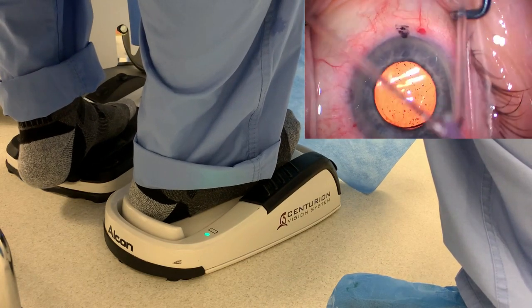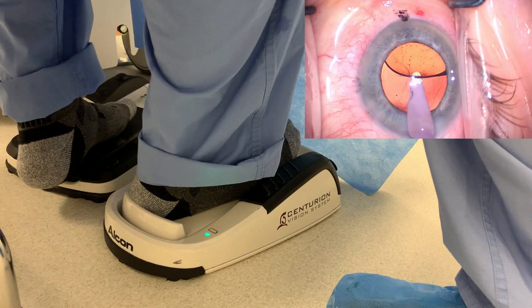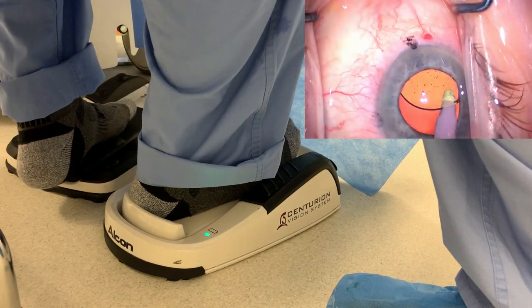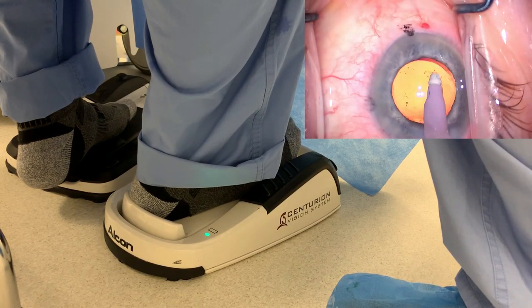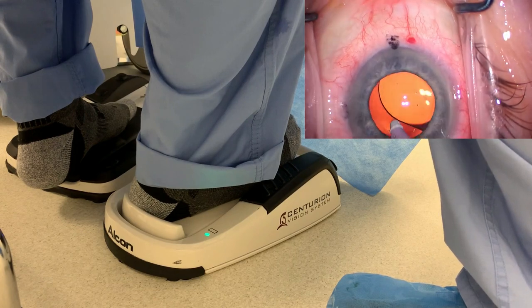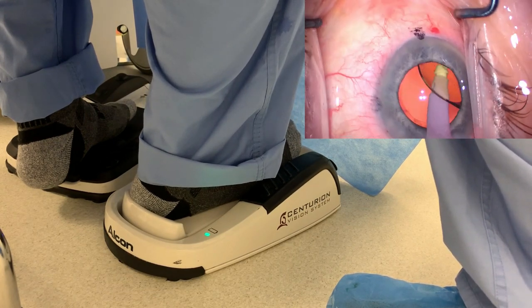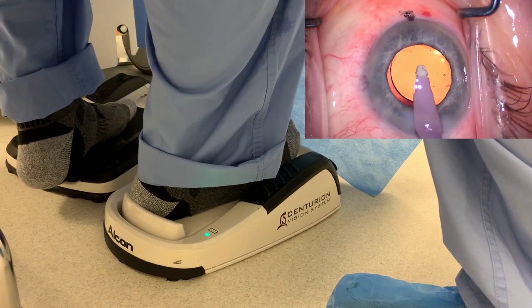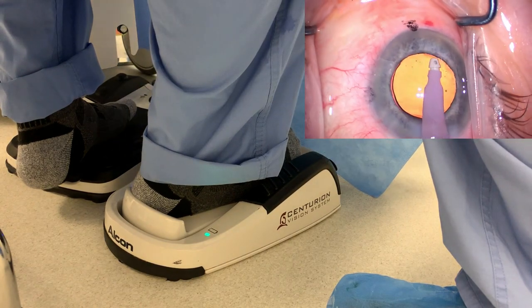Now here comes the I/A probe — irrigation's on. I'll leave it in position one, get under the IOL well, and now I'll give more vacuum. I like to remove all the viscoelastic from behind the IOL well — that looks fantastic. Cleaning up the anterior segment as well. If there's any remaining viscoelastic, I'll still go back and get it. Here we're just titrating the degree of vacuum with foot pedal position two — a little more vacuum or a little less.